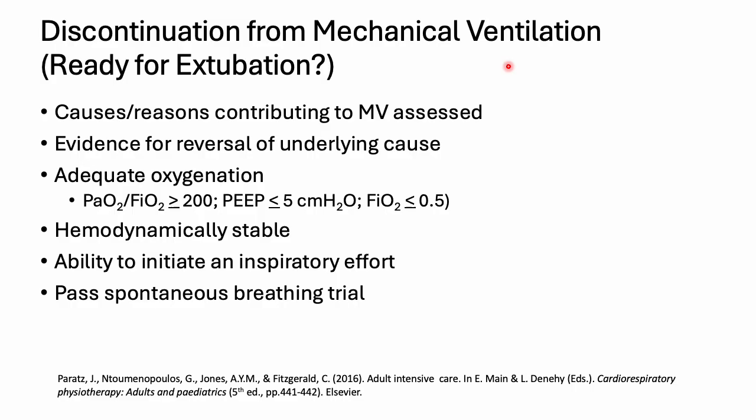It may not necessarily mean the removal of an artificial airway, but if a person is intubated in the ICU on an endotracheal tube, and the tube was placed in the beginning for mechanical ventilation, then weaning of mechanical ventilation also equates to extubation, the removal of the tube. To extubate means to remove the tube, the artificial airway. So weaning means the process of getting the patient off the machine, the discontinuation of mechanical ventilation.